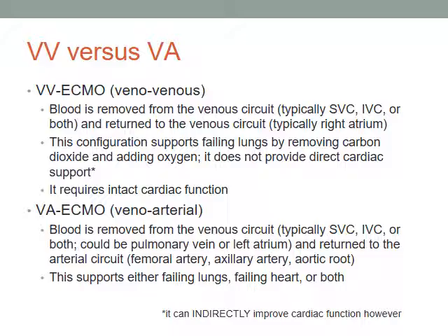The other thing that can happen is often patients with respiratory failure have very high thoracic pressures. We've been beating them up with a ventilator. Ventilator pressures are high. You don't get good blood return to the chest because the pressures are high. We put you on ECMO. One of the first things we do is turn down the ventilator to safe pressures. So now we have pressures that have gone from 40 down to 20 or 25 in the chest. We're now providing oxygen to the heart, and suddenly that patient who's on three pressors maybe doesn't need anything.